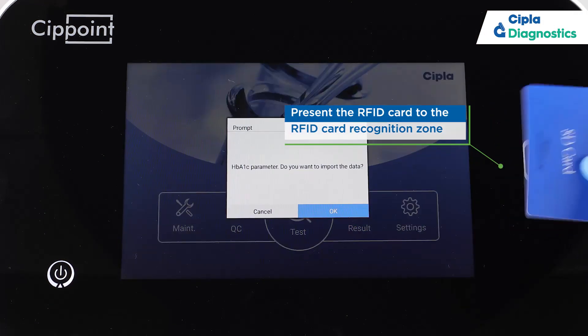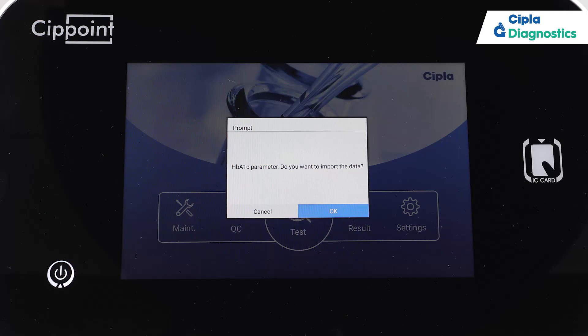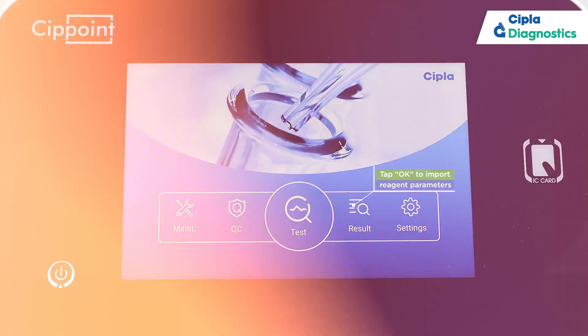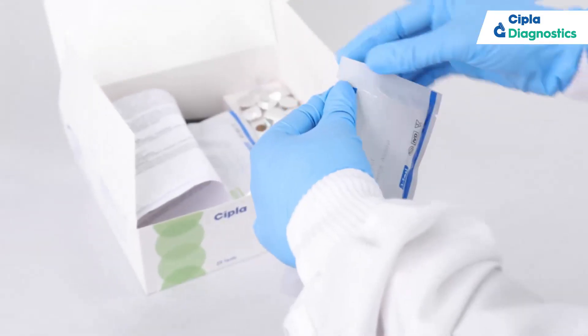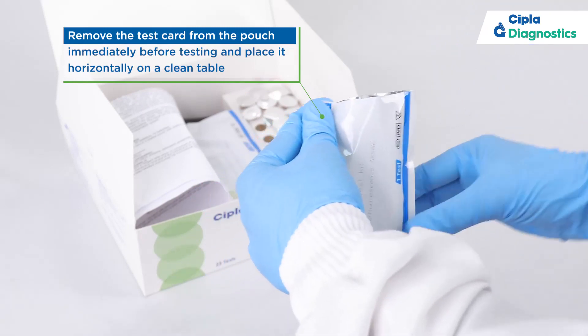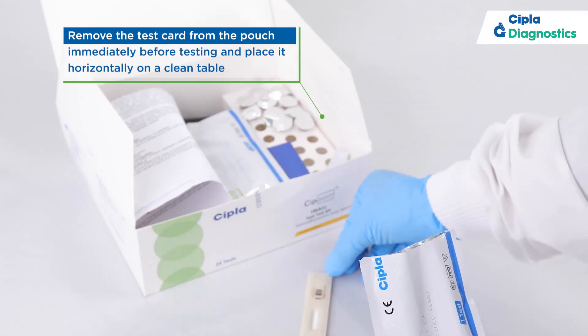Present the RFID card to the RFID card recognition zone. Tap OK to import reagent parameters. Remove the test card from the pouch immediately before testing and place it horizontally on a clean table.